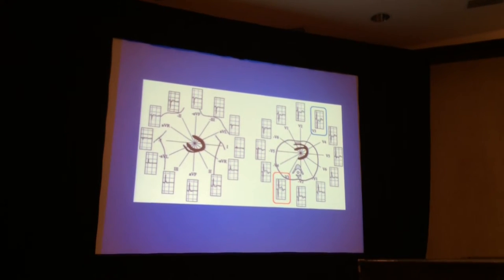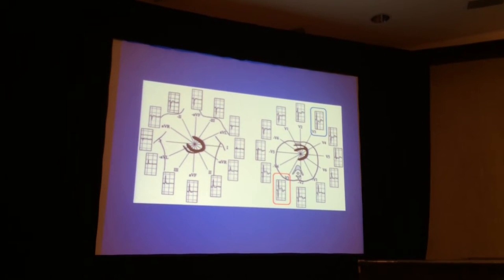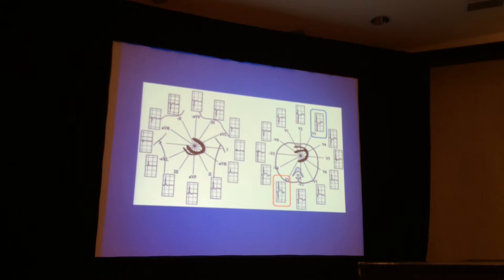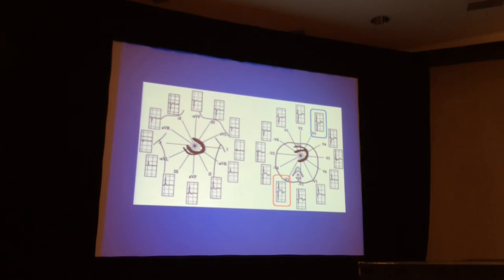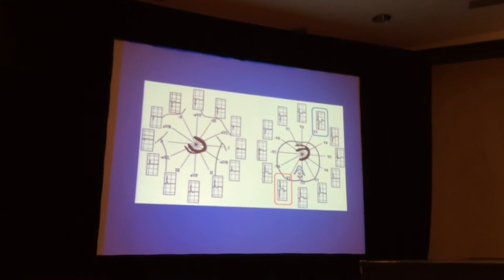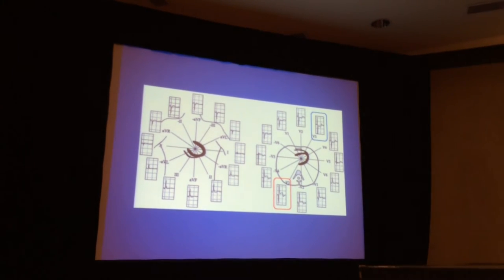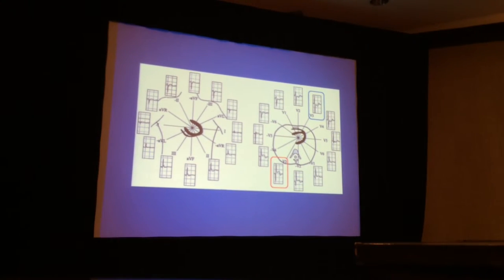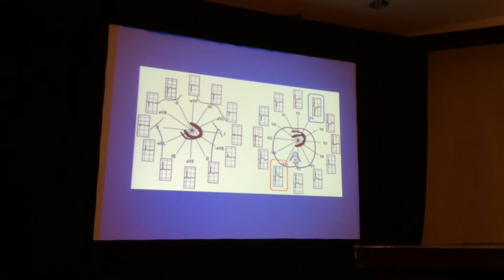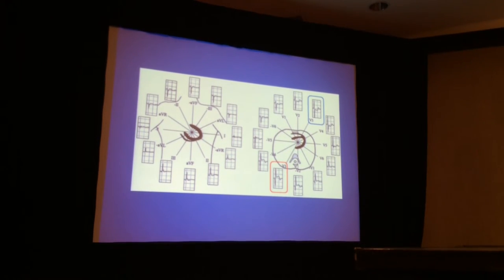And if they wanted to see whether something is going on in the back wall, they would put electrodes on the back. But you don't really need to. What you can do is the same thing by holding the paper up to the light, turning it upside down, but why not just construct the antipode? And as you can see, in this case, there is ST elevation in minus V1, minus V2, maximal in minus V3, some in minus V4.